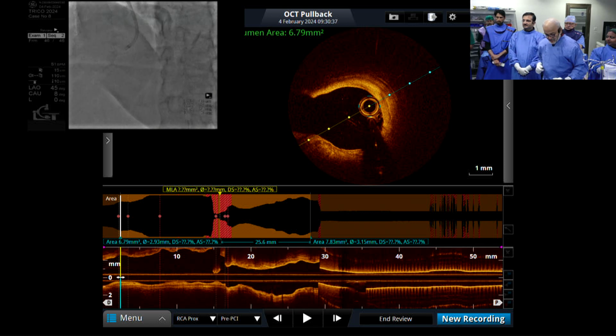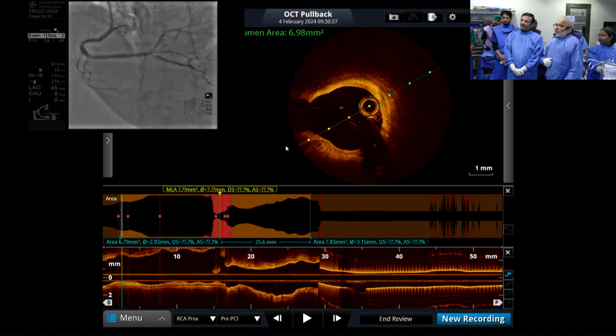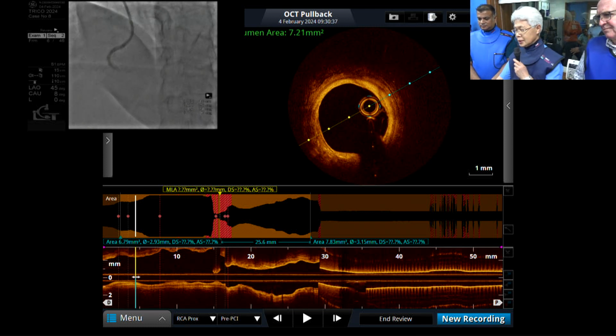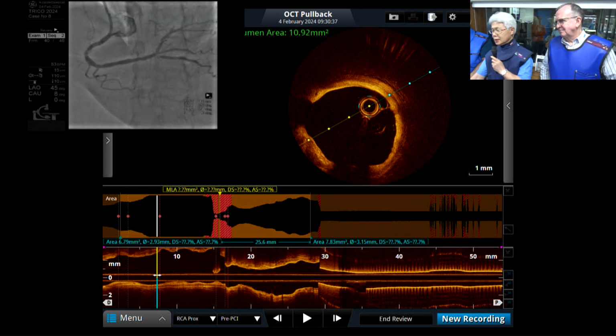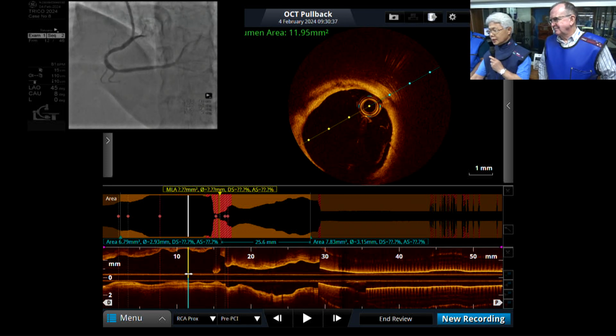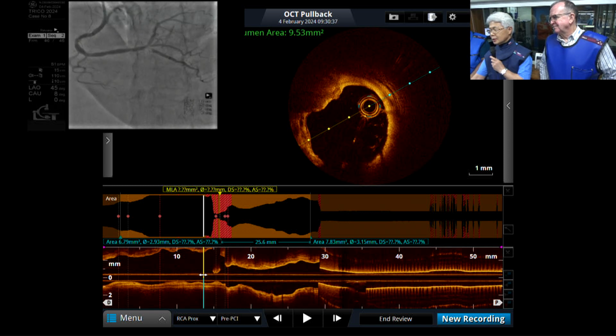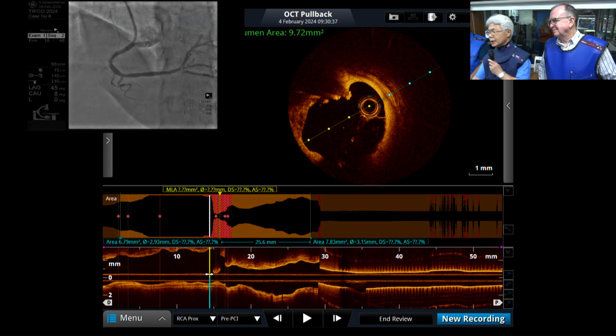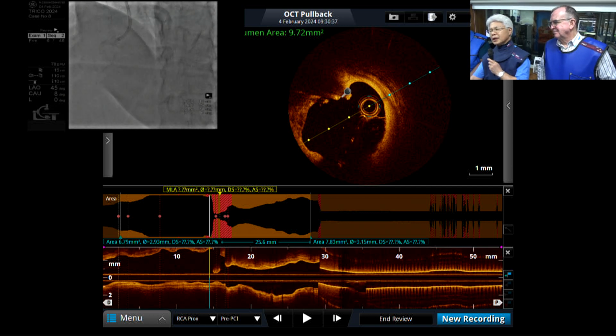Yes, okay, Professor? Okay, here is an acute marginal. You can identify here, right? Then I try to provide another branch. Can be seen, right? But another branch. There are 3 branches, right? Then yes, here might be the nodule. Big nodule. Calcium nodule, and then some elapsed, right?